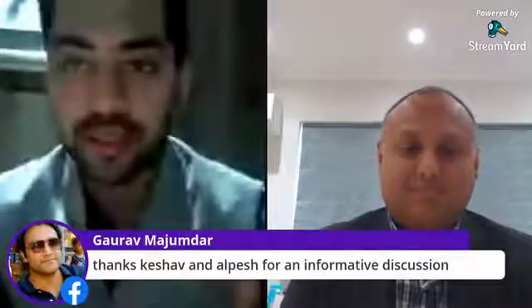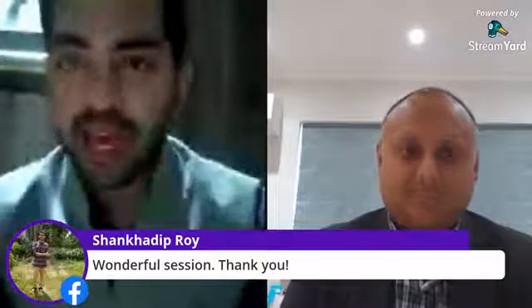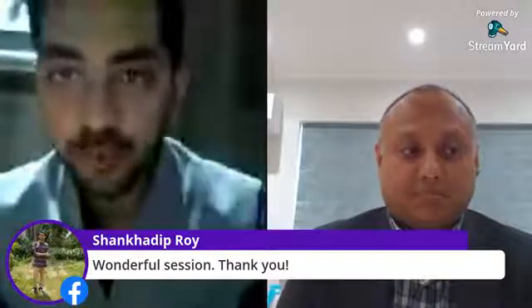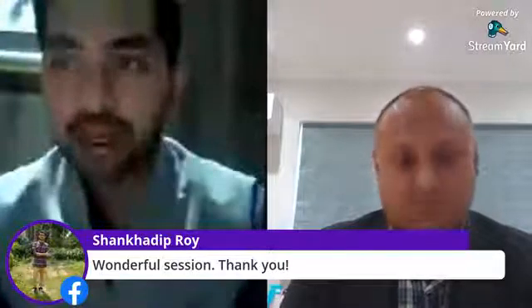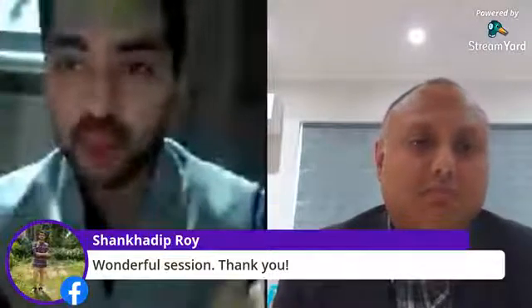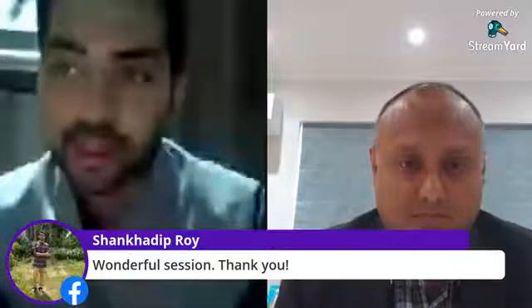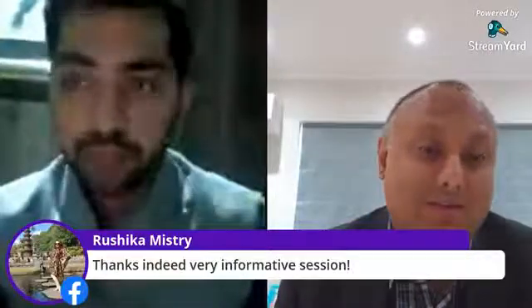You have to take the gas readings properly, maintain all your QC in place, and these are things that we have to consider. Last thing that I want, Alpesh, you to touch upon is the documentation process in the laboratory now, and maybe a little bit more on consents and how important it is now to counsel our patients effectively. How do you counsel your patients, or how do you intend to counsel your patients once you begin the clinic, regarding the risk of transmission? Yeah. So one thing which is very important is that patients are aware that their cycle could be cancelled. That is the biggest risk that patients need to be aware about.